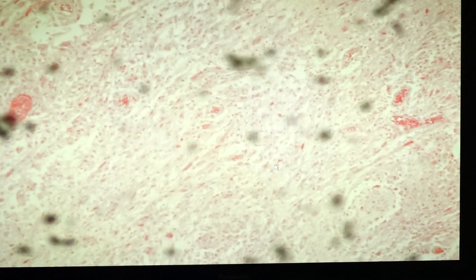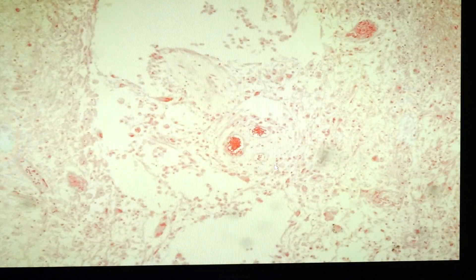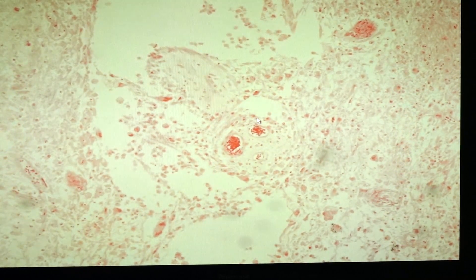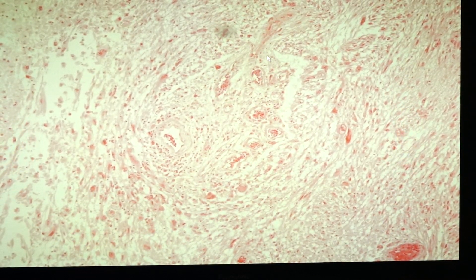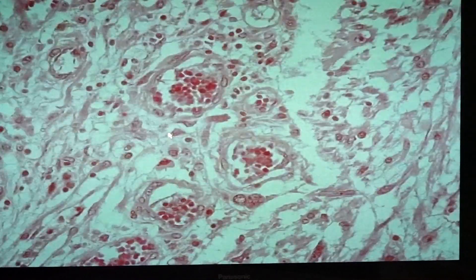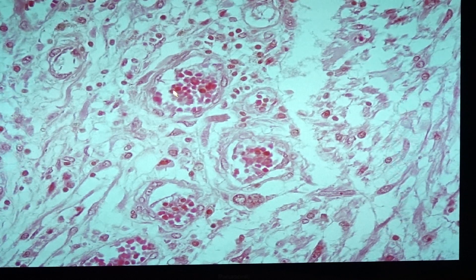Here are more aggregates of blood vessels — this is a better appreciation of the glomeruloid body. You have the presence of blood vessels in aggregates. The book states that the blood vessels should have at least a double layering of the endothelial cells, and you can see that double layer of the endothelial layer here. This concludes slide 91, glioblastoma multiforme.